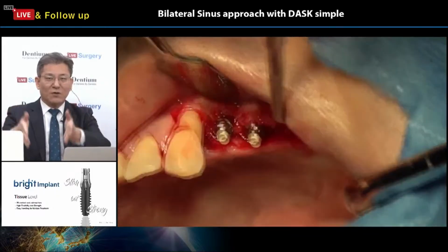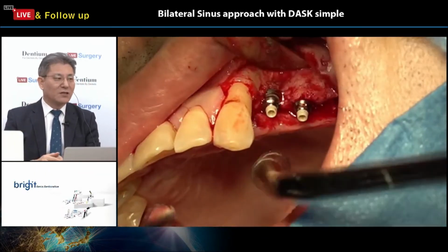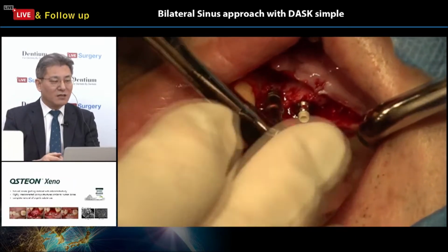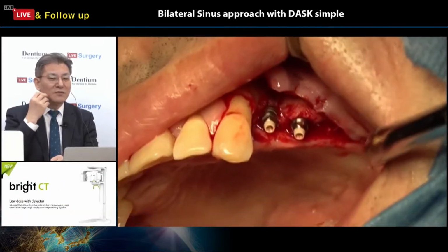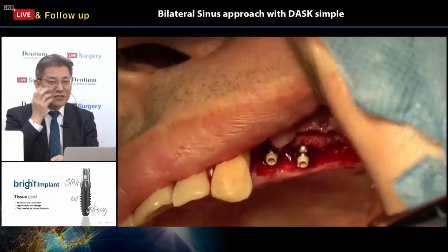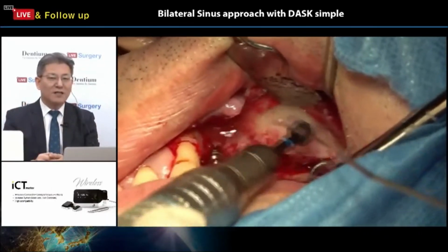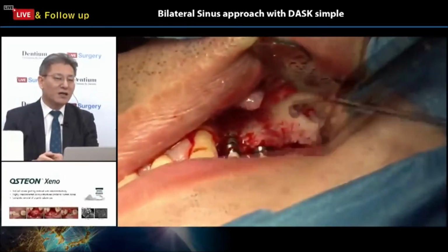And also the top portion of this S curve of the fixture has an auto stop function. So don't worry about this. You don't need to worry about too deep an insertion, especially in a tight situation like the lower mandibular area, where there are nerve or sinus areas, and many nervous regions around here. When you use this tissue level implant fixture, you don't have any fear because the top portion of the S curve of the tissue level gives us an auto stop function. It doesn't make any deeper insertion like bone level.